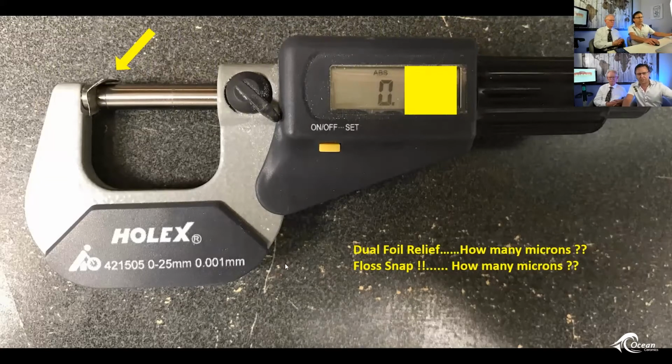So what you see here on the screen on this yellow arrow is I took double foil and I folded it in two and I put it into the micrometer. It's 100 microns. 100 microns is 1/10 of a millimeter, which is a country mile. So we always ask ourselves, why do we feel we have to allow such space allowance with bites? We know people don't want to adjust their bites into place, but typically we check our occlusions with a 40 micron occlusal paper on a single unit.